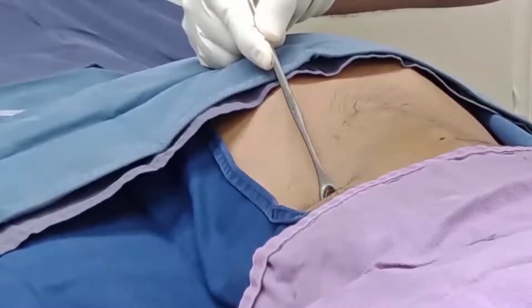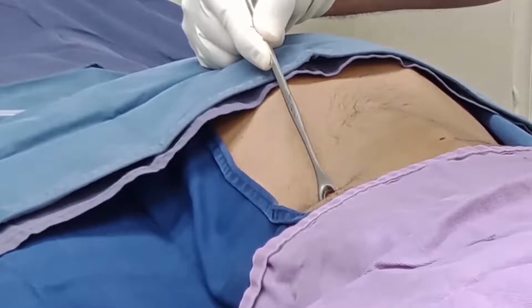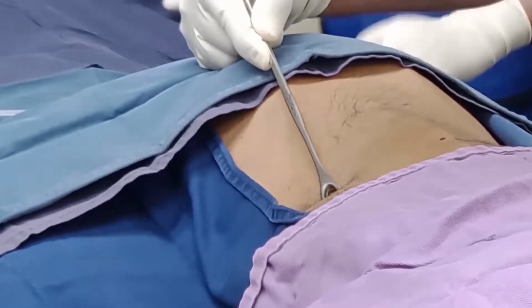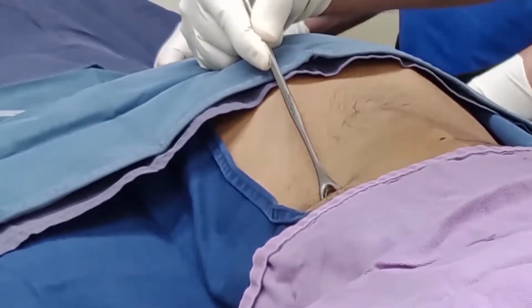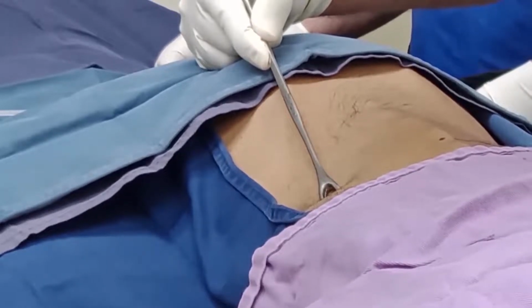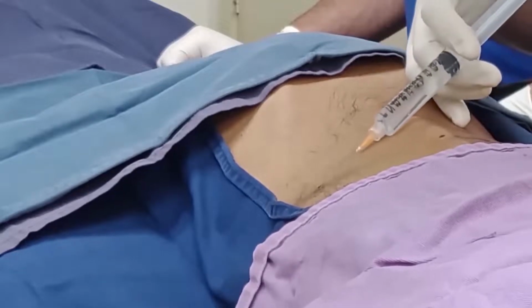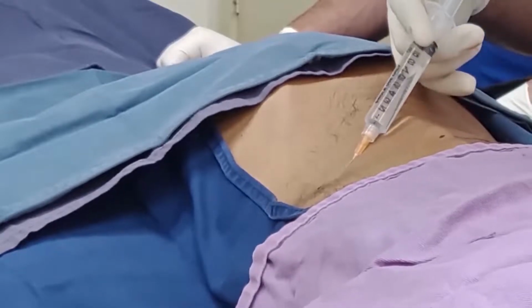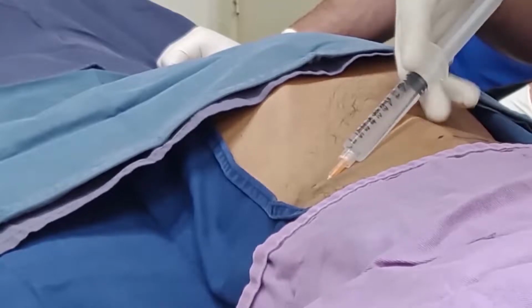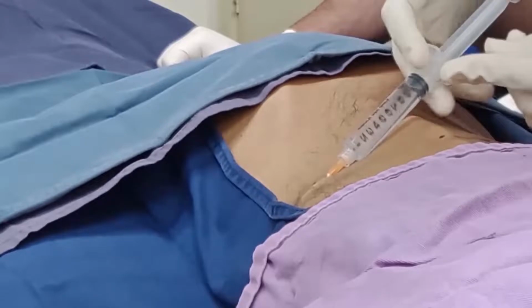Now we're going to mark the skin by looking at the X-ray image and identifying the lower border of the 12th rib and about 7 centimeters lateral from the spinous process. 2% lignocaine is infiltrated in the marked or identified puncture site.